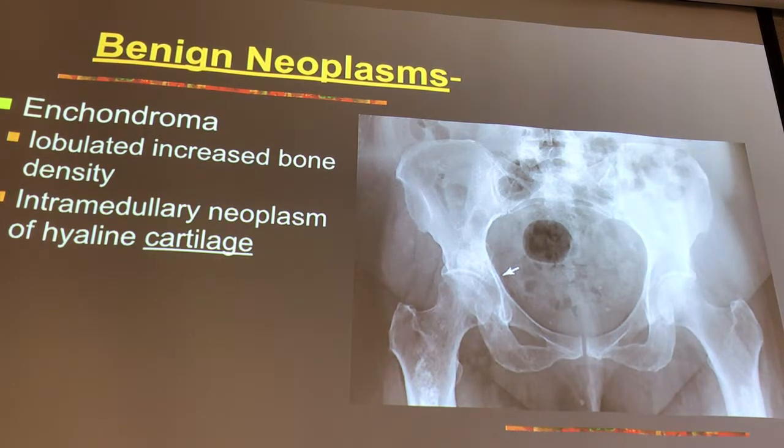So now what happens if you change the technical factors? You affected the entire area. So it would be no. Right? If it's taking up the whole thing, then yes. If it's just a little thingy, then no. Because they're just going to see that dense area on your image, because it's going to be, oh yeah, white. Right? So it didn't penetrate. They see it as that. It's done. All right? So no. The answer for this one would be no. I'm not changing the technical factors because it takes up too small a place, right?